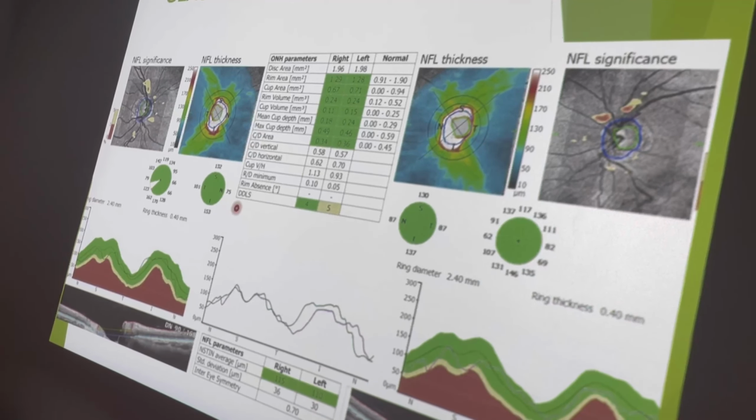Six months will be more than enough if you are checking 1 to 2 times and it's stable. Three months first, a baseline for the patient. In the first year we can do it as early as 3 months, then 6 monthly. If the patient is stable, only yearly is needed. Initially, learning curve fields. Stable, OCT yearly.